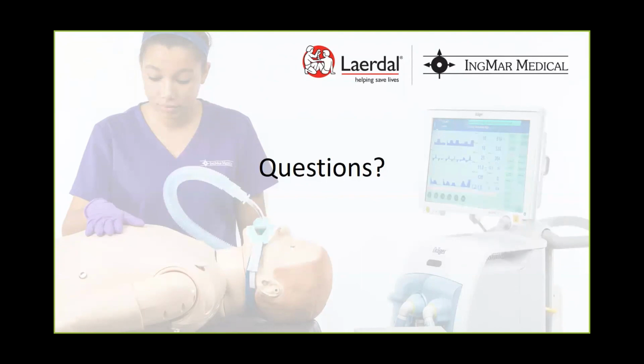Joe, will there be chest rise when the ASL 5000 is in the mode that bypasses the SimMan 3G lung bags? Yes. Because at that point, we actually look at chest rise and fall the same way that we always have. So we're just looking at the given breath by the ASL 5000, then chest rise and fall will respond accordingly.